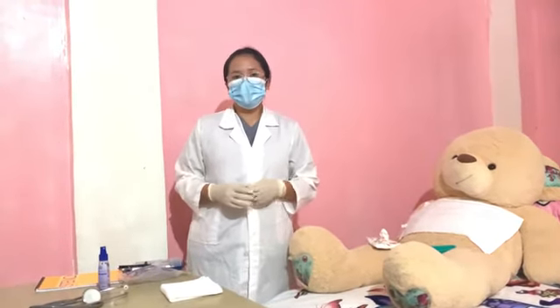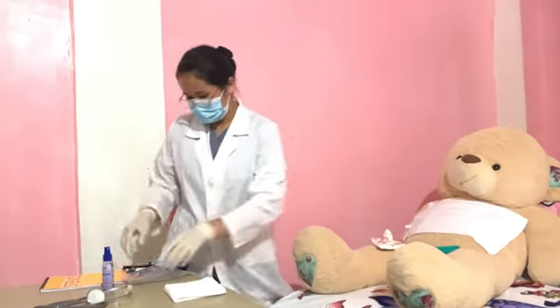And then measure the distance to insert the tube by placing the tip of the tube at the patient's nostril and extending to the tip of the earlobe and then to the tip of the xiphoid process.